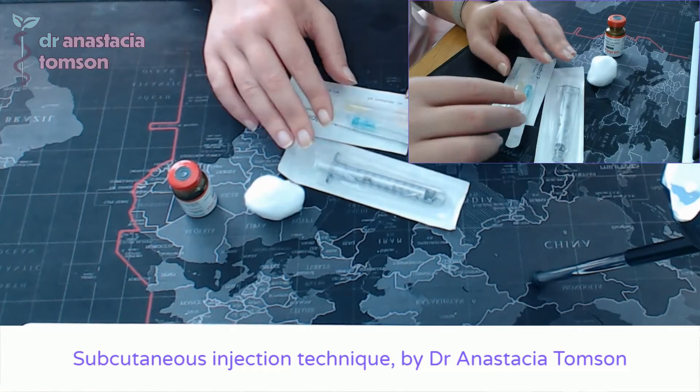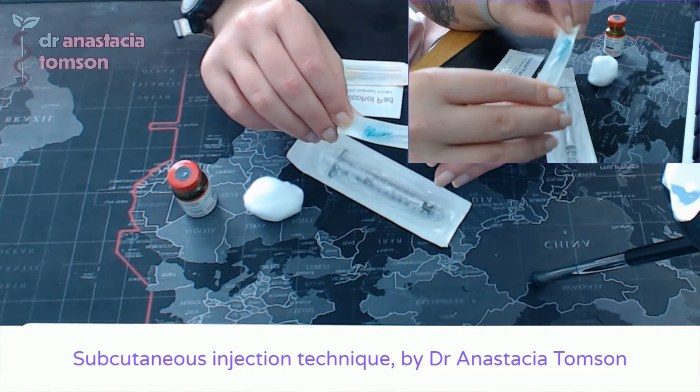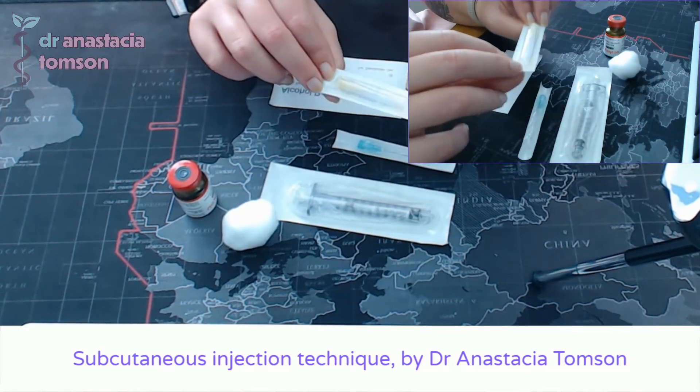Just to make sure you can see all of this: my syringe, my 21 gauge needle for drawing up the medication — this is the one with the green plastic hub — and then my 30 gauge needle for doing the injection.